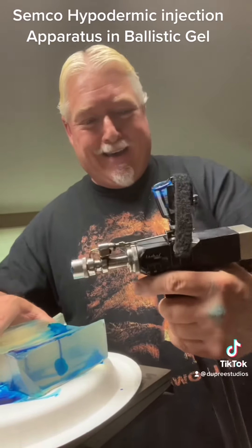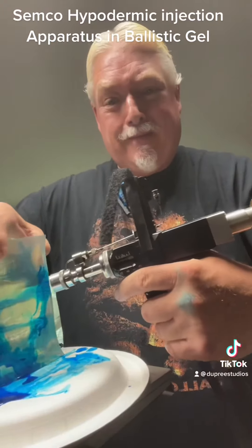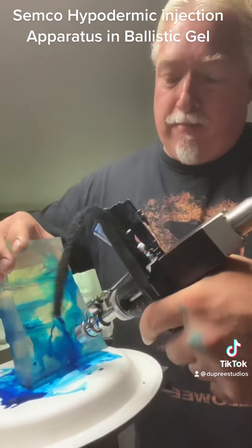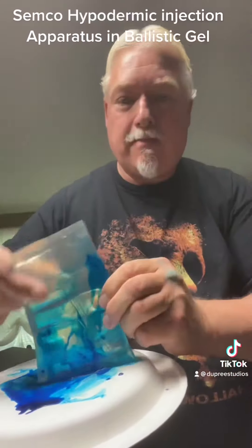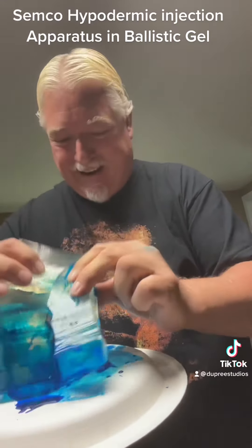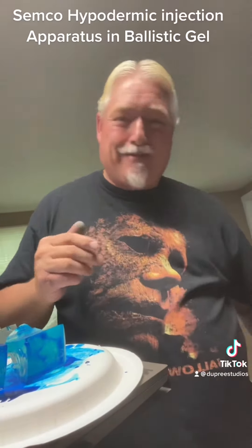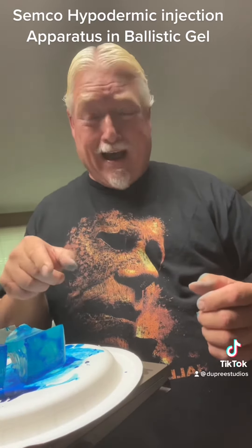Now we're going to pump it up and show you what happens if you move. You can see it ripped it right in half. So that's what you can expect from the Semco hypodermic injection apparatus.